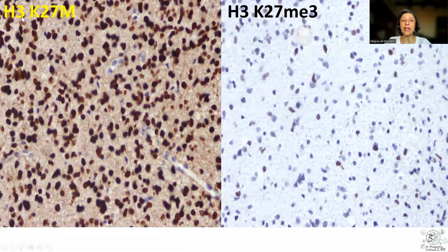These are the H3K27M — what I call the capital M — and the H3K27ME3. The combination of these two stains would support the diagnosis of diffuse midline glioma, but they are interpreted in a completely different way.